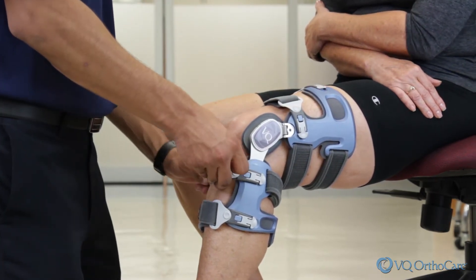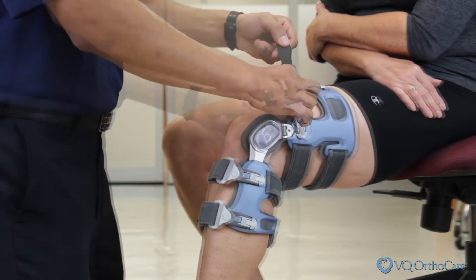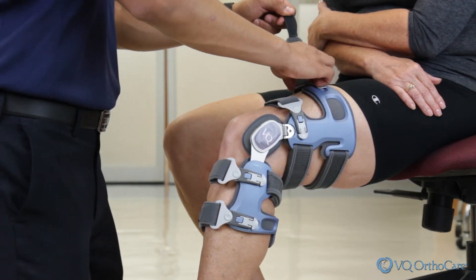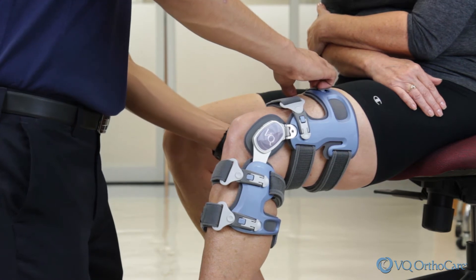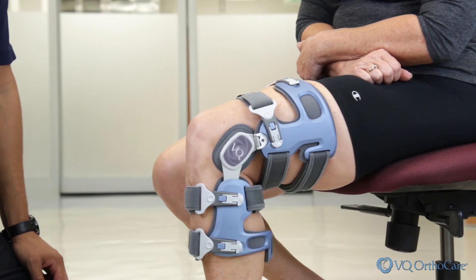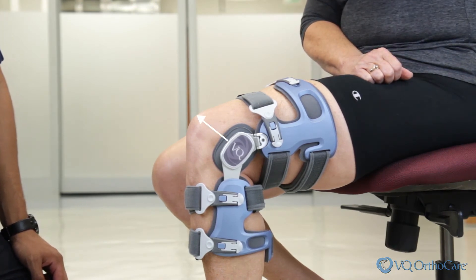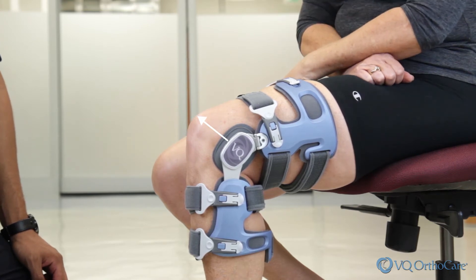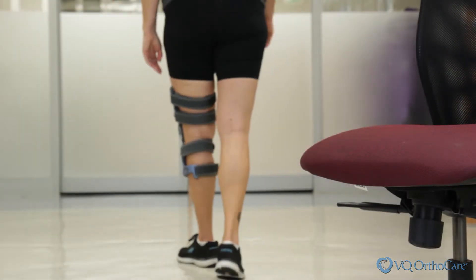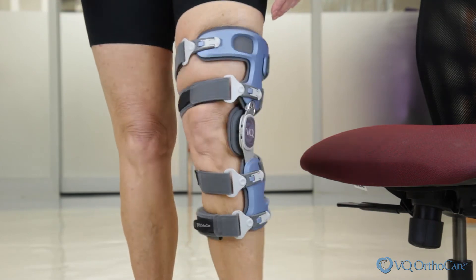Hold the brace to prevent rotation while tightening straps. All straps should be comfortably tightened to properly secure the brace and provide relief. Do not over tighten the thigh straps. Once the straps are secure, check to make sure the center of the hinge is still aligned with the top of the kneecap and positioned slightly behind the midline of the leg. To ensure it is properly fit for activity, walk a short distance. It is normal for the brace to drop or settle into position slightly.